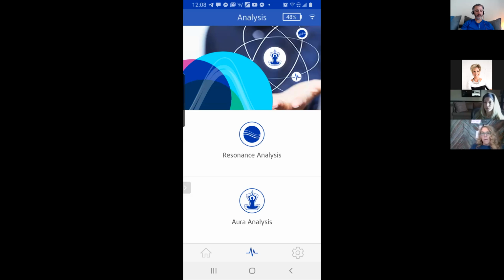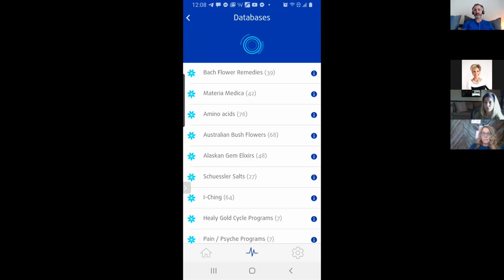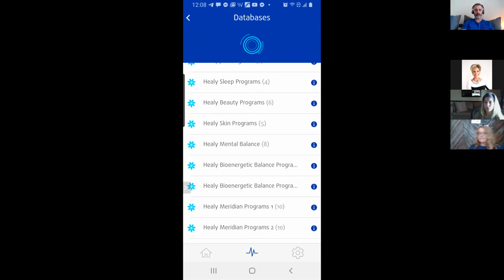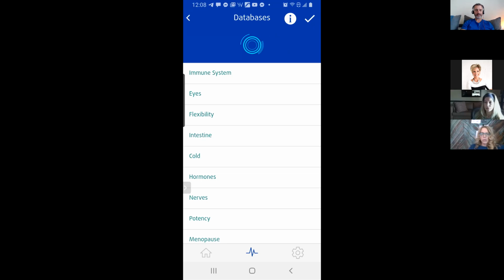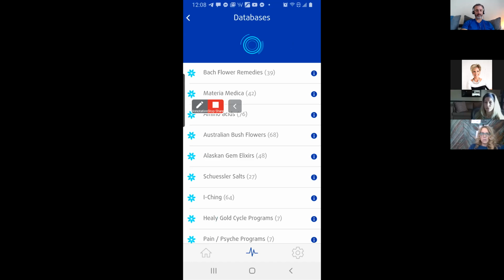Okay. So if we go back up into here and resonance, one thing you'll notice is I can see what different programs are on these, on that blue information thing on the right. I can see, okay, here's all of the different programs that this particular one has, okay? So if I was curious maybe, and I'm here now, I could just hit this edit button over there to go back out here, okay?